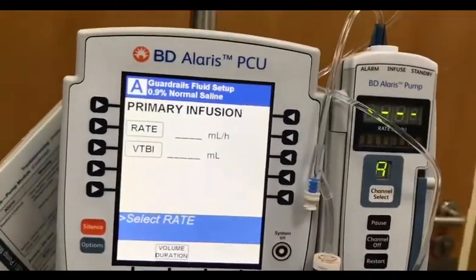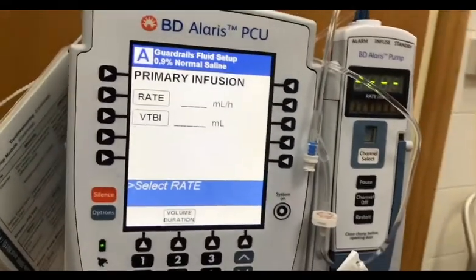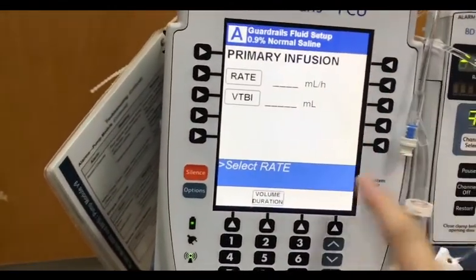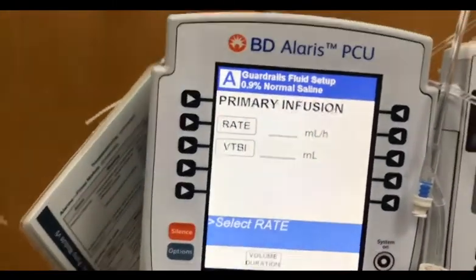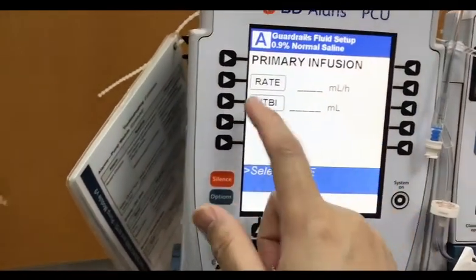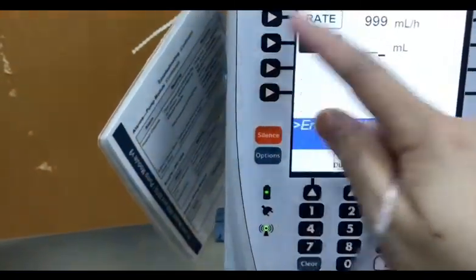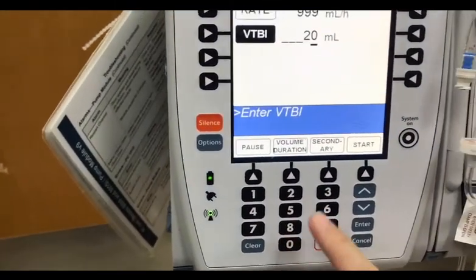In ED, usually the doctor will order the fastest bolus. Like for example, 1000 ml. The doctor wants to infuse 1000 ml. In this machine, it doesn't have 1000 ml per hour. But instead, the maximum rate or ml per hour that we can infuse the patient is 999 instead of 1000. So just press here 999. Volume to be infused, like for example 20 ml, just press the 20 ml.